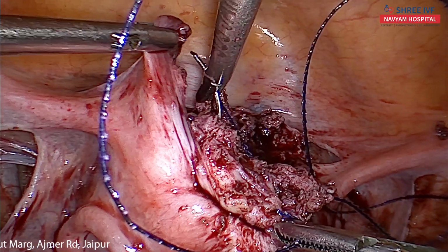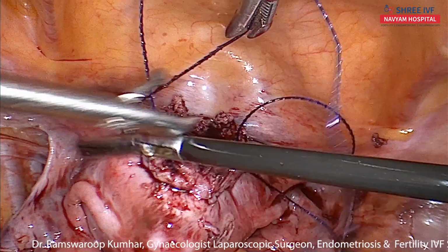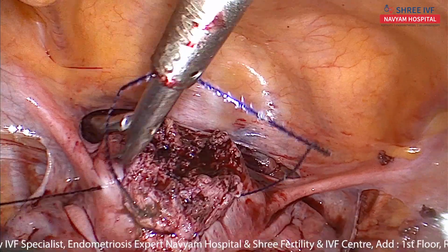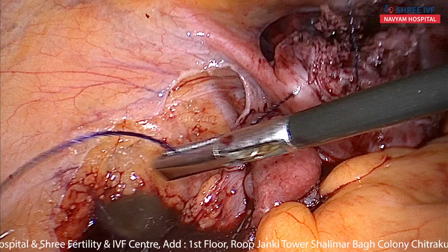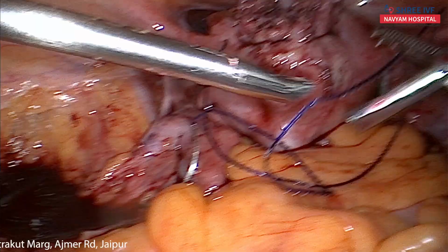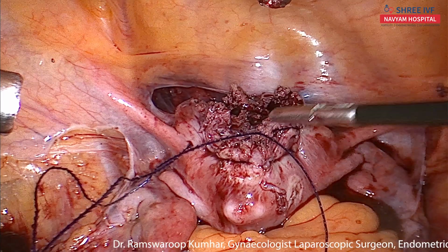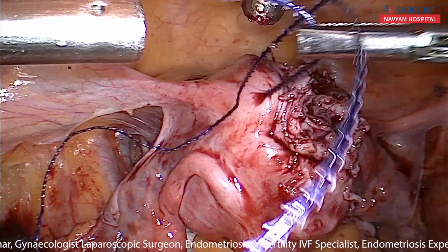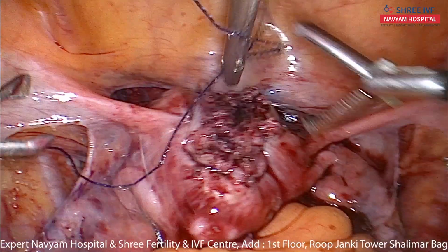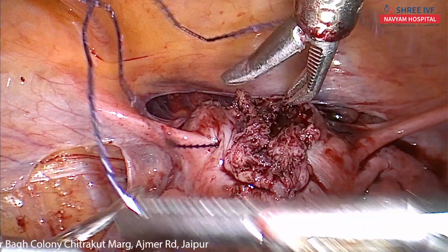This is very deep and dead space here. So we will take it deep. Pull it. Good. Now I will get more.